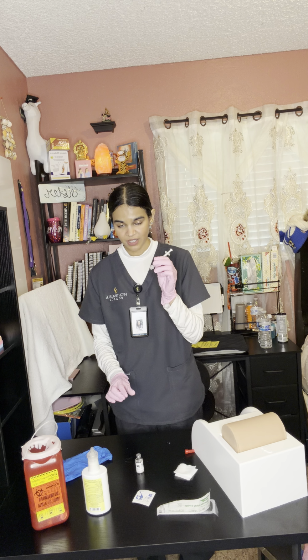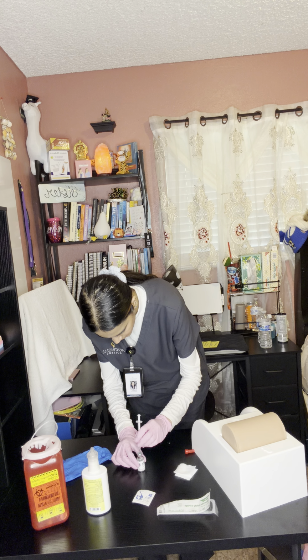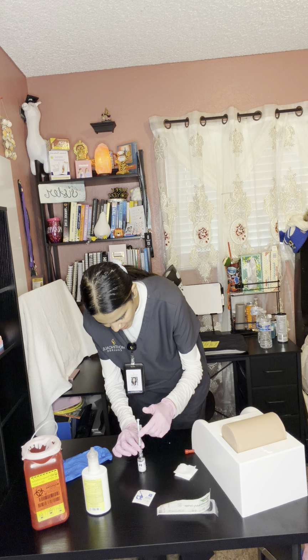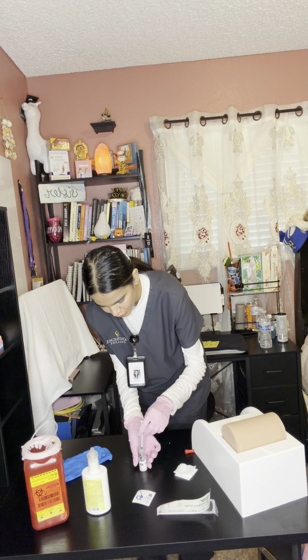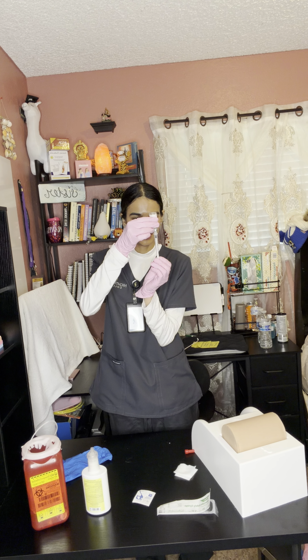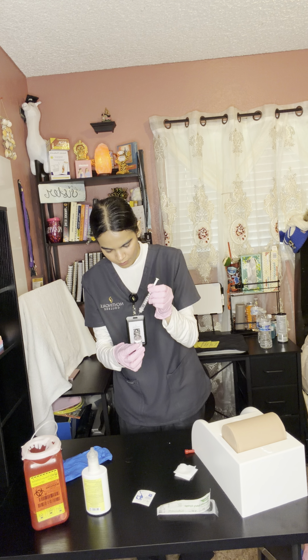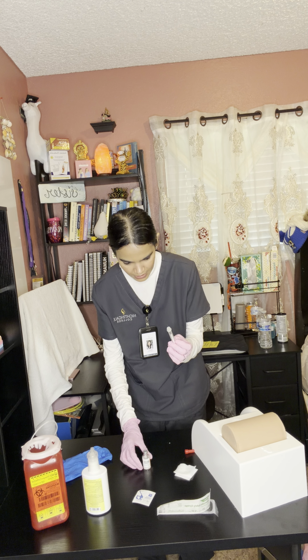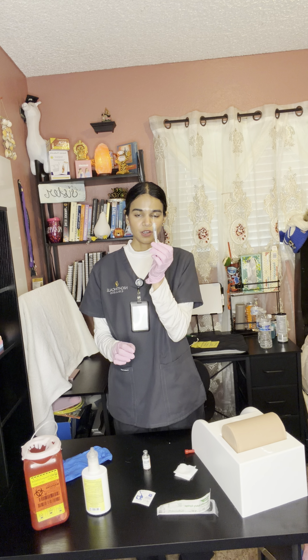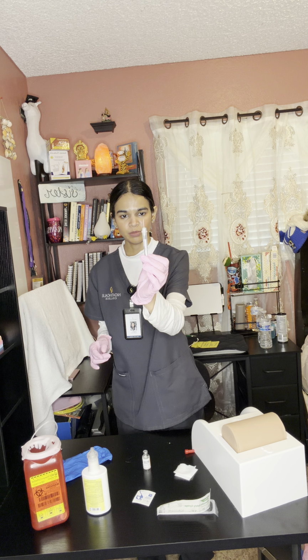I will then inject the tuberculin vial with the syringe. We are not drawing up any medication. I will release the air into the vial. I will invert the tuberculin vial and we will draw up 0.1 ml slowly. While you draw up the medication, be sure that there are no air bubbles present. If there are, just simply tap the syringe. Here, there are no air bubbles present.